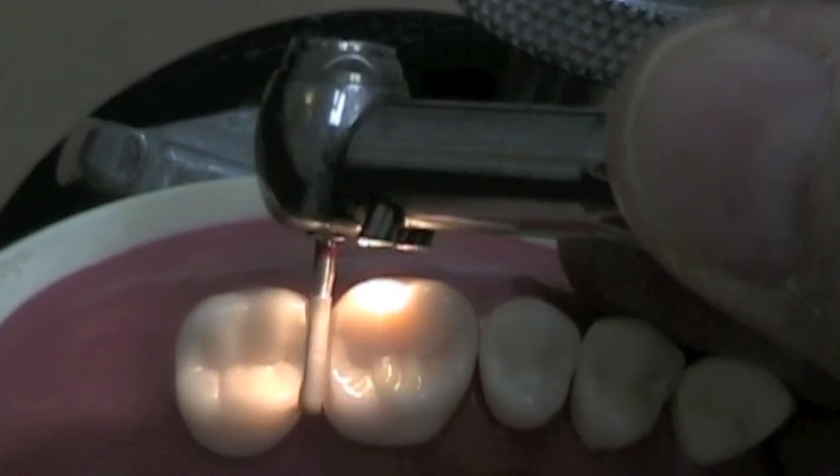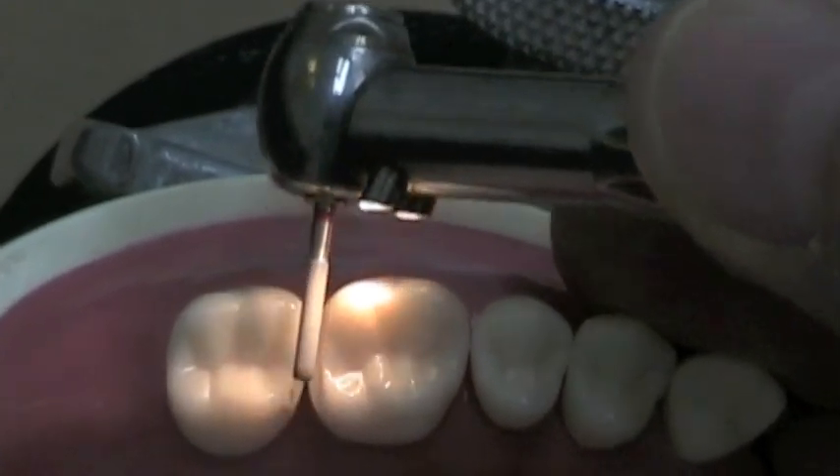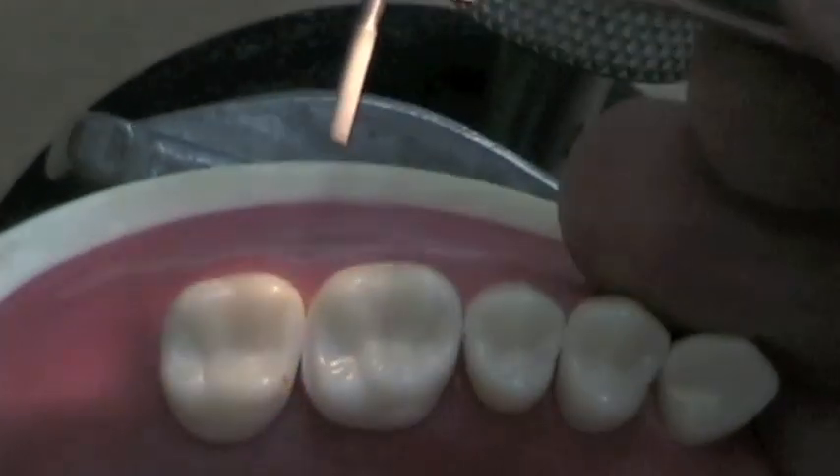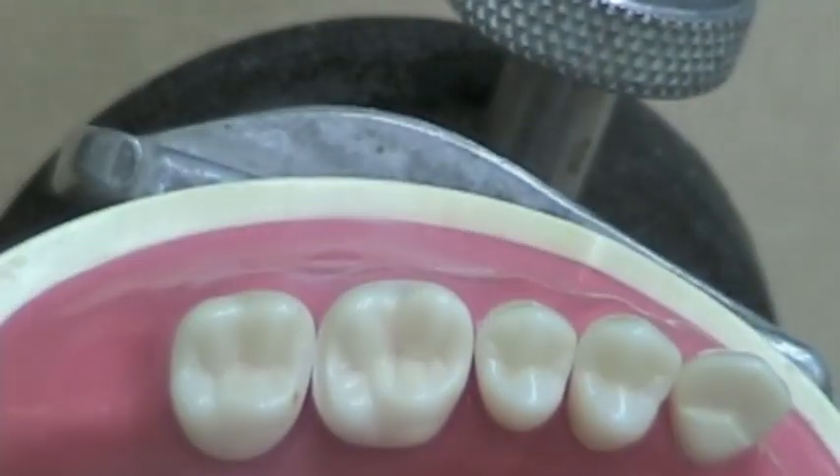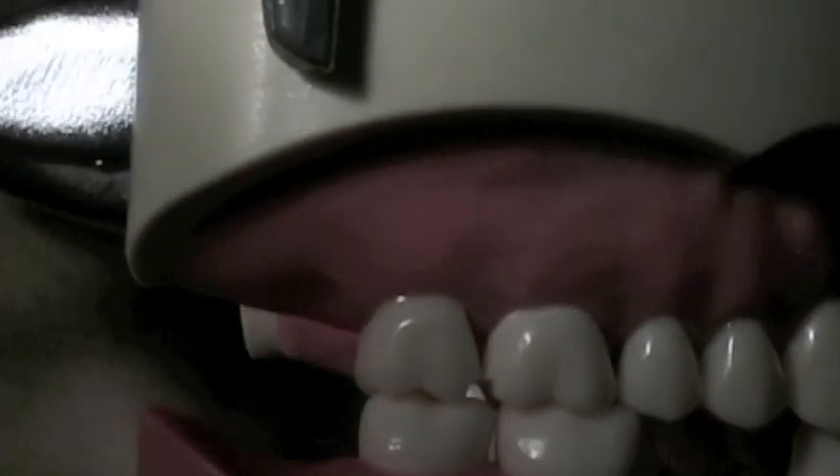When you have sufficient preparation, you should be able to see 1.5mm of clearance when the patient is in maximum intercuspation. If you take your typodonts and occlude them like this, you'll be able to check for that clearance.